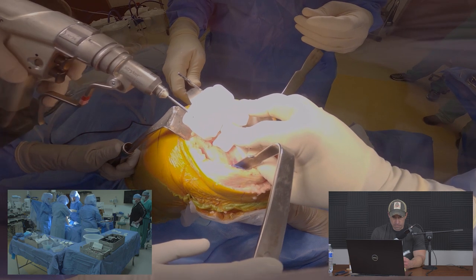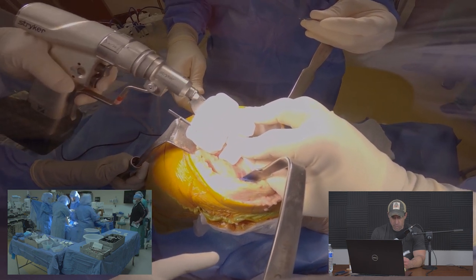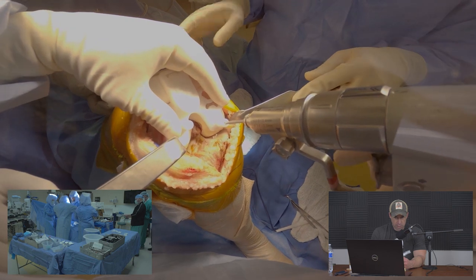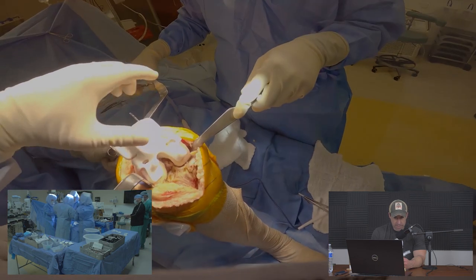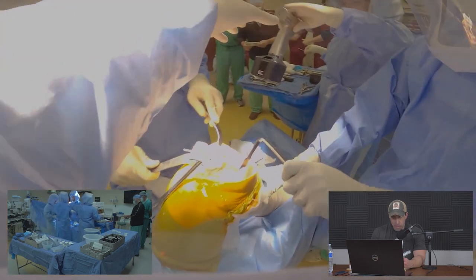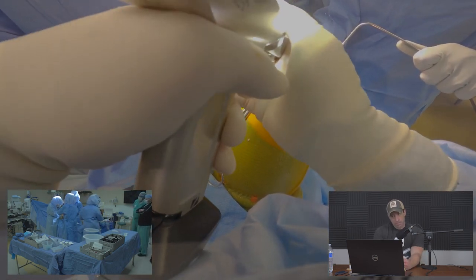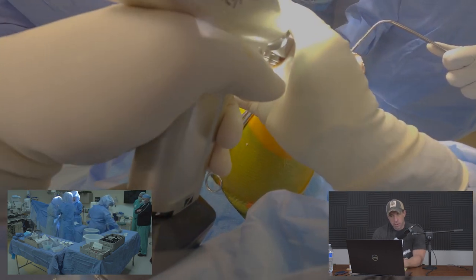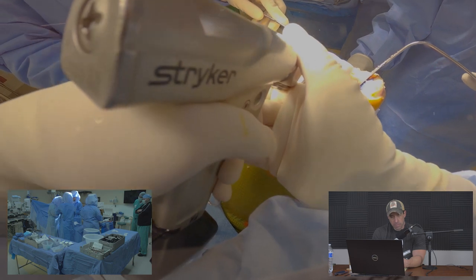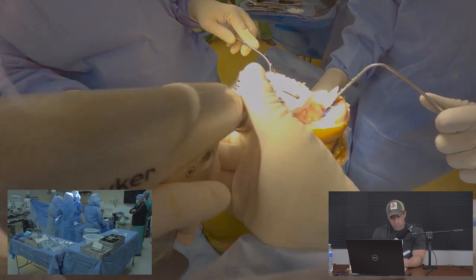With the pins in place I use a drill to prepare two holes for a subsequent guide. Part of that guide is then removed as we change position. The amount of bone being cut is known from the pre-made surgical plan, and I verify those measurements match what I'm seeing. This is the distal femoral resection — removing a little cartilage and bone from the end of the femur.